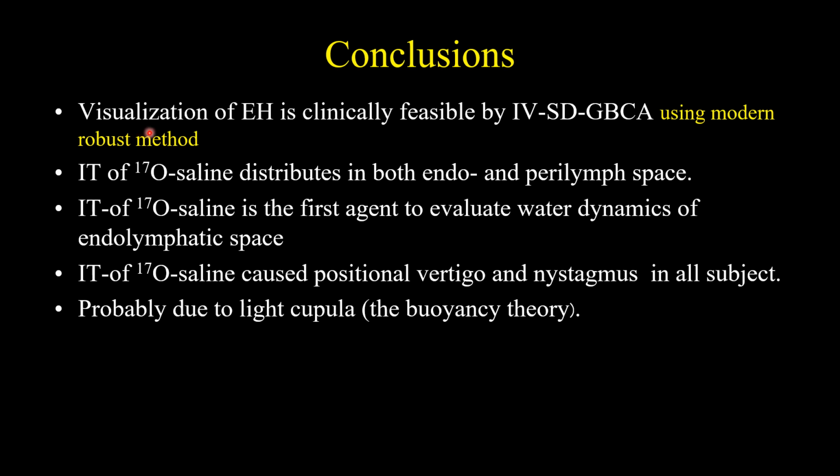In conclusion, visualization of endolymphatic hydrops is clinically feasible by intravenous injection of single-dose gadolinium-based contrast agent using modern robust method. Intratympanic injection of O17 saline distributes in both endolymph and perilymphatic space. So we cannot use this agent for the visualization of endolymphatic hydrops. But intratympanic injection of O17 saline is the first agent to evaluate the water dynamics of endolymphatic space. This is, I think, very important.